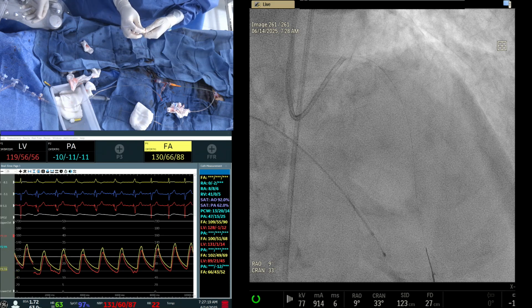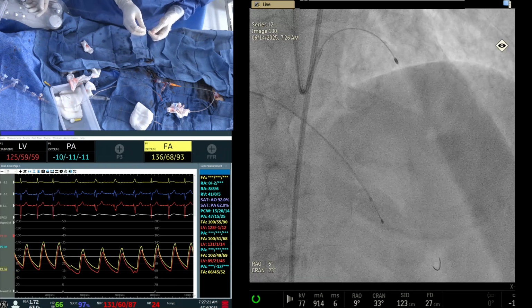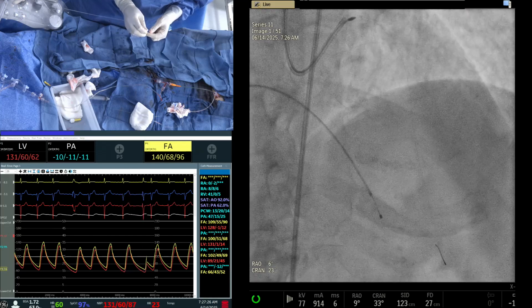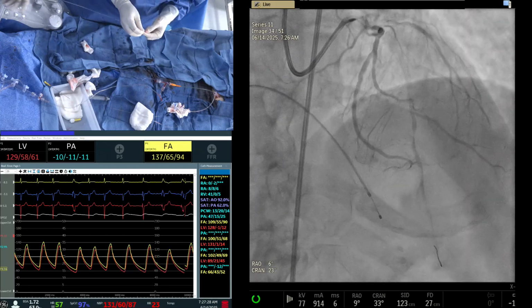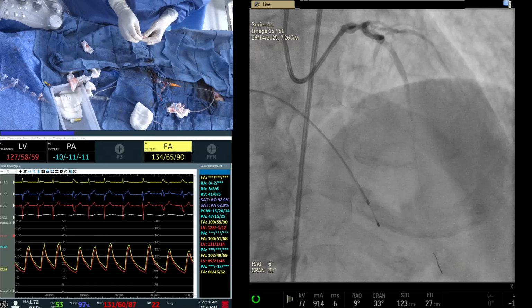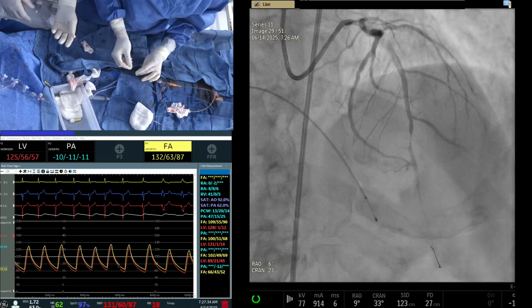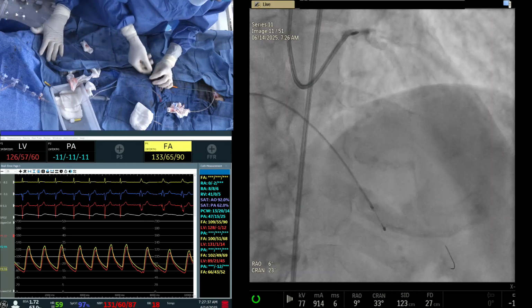Okay, let's say the stent strategy. You want to take an imaging and see the design? That also we can do. Yes, there's a long lesion in the LAD, right? So use a long 2.75 by 32, 33. No, I put a 2.5. Okay, 2.5. Let's balloon and see.